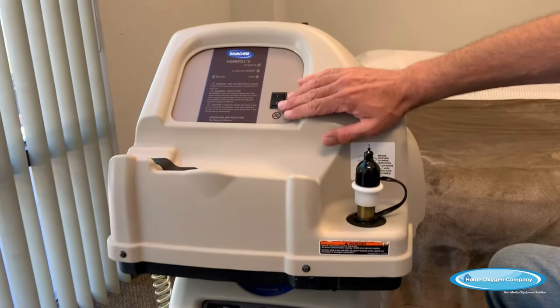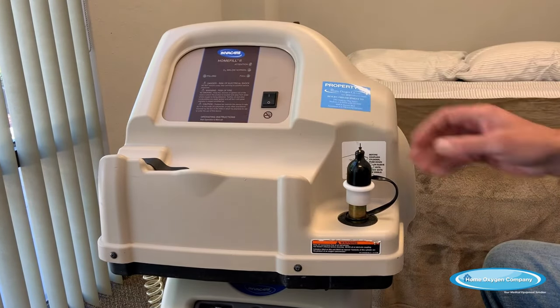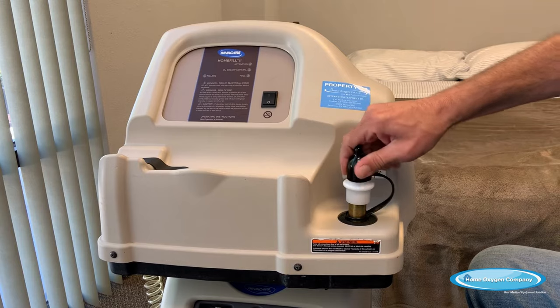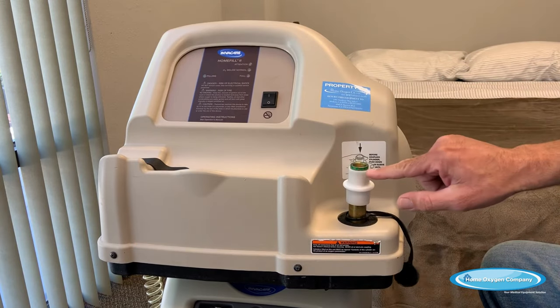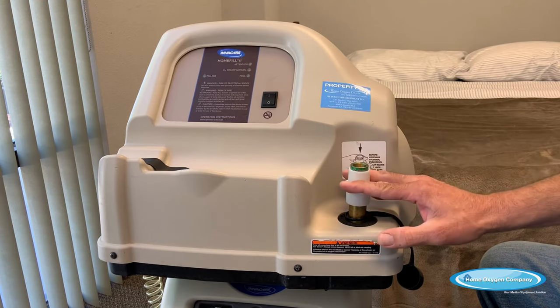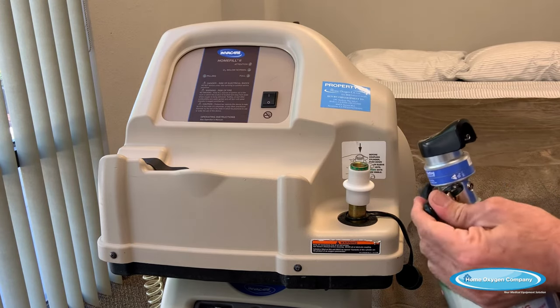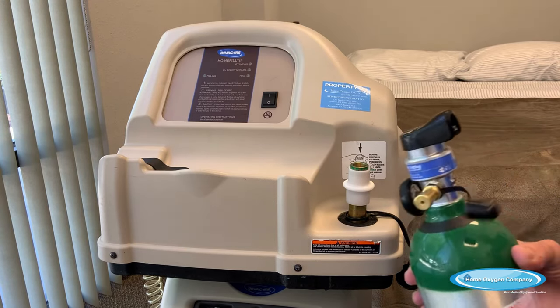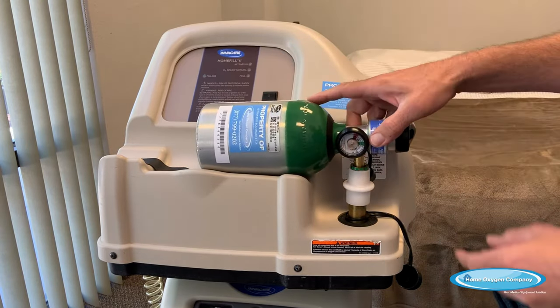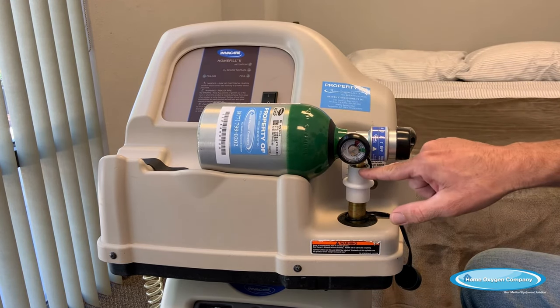Next, you need to make sure that your home fill compressor is in the off position before you load the tank. This is just a dust cover — you always want to leave this on when the home fill is not in use. We're going to take it off. You will see a row of green dots, which means that the coupler is in the ready position to accept the home fill tank. Take the dust cover off of the home fill tank.